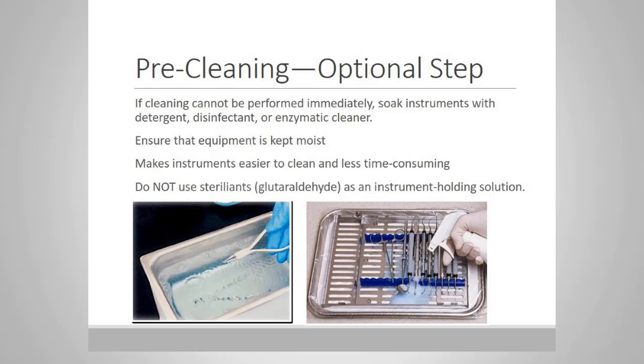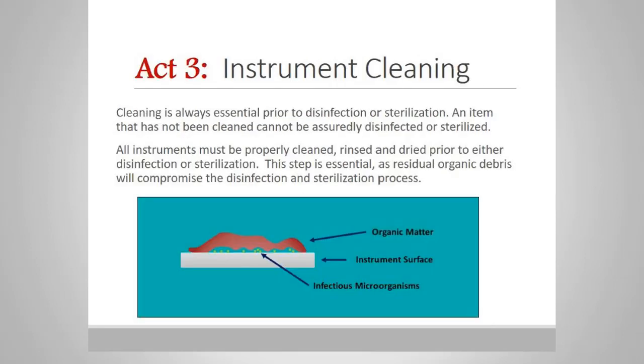And once again, that loosens up the debris and prevents it from adhering to the instrument, and it makes cleaning easier when you can get to that task. So many practitioners or clinicians will pre-clean their instruments, spray them with an enzymatic cleaner, go turn over their operatory, and then come back and reprocess the instruments. But keep in mind, this is an optional step, but it may make your life easier in the long run.